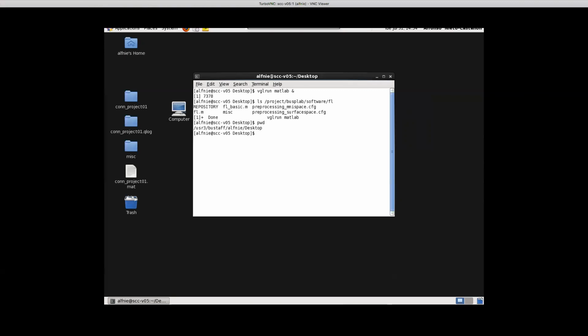It's true that it's feasible to do it the other way, to keep the resampling all the way up to second level analysis and do the first level analysis in the subject space, but I think it's unnecessarily complicated. Given the level of smoothing that we use for second level analysis, the additional smoothing incurred by interpolation is minimal compared to the smoothing we do to account for different anatomical structures across subjects, and the level of smoothing we typically use for both volume level and surface level analysis. So I think it's just an unnecessary complication to do it that way.